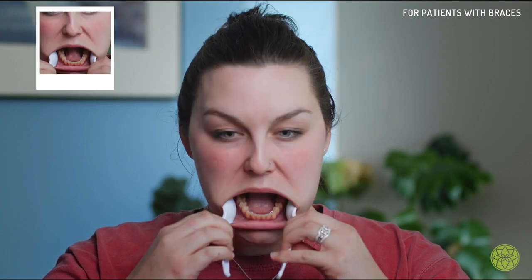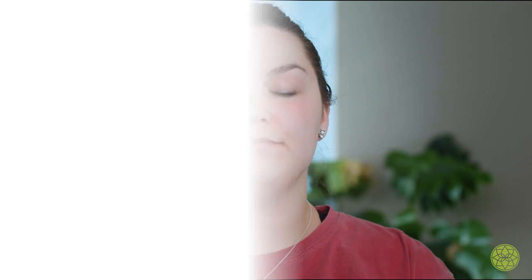We're going to use the spoons again, putting them on your lower lip, pulling down, and open up super wide making sure that we can see all of your teeth. Again, use your flash so that your pictures are not dark.